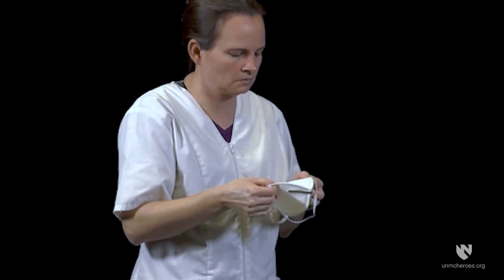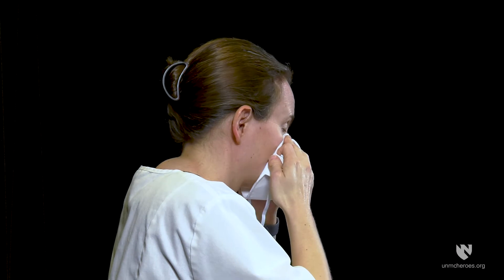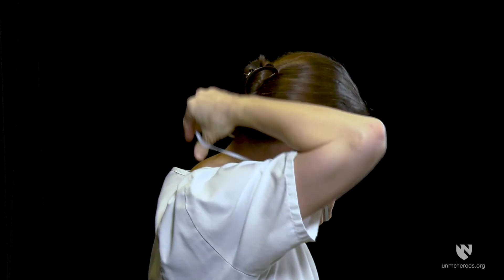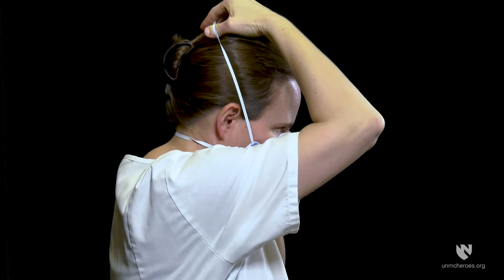Open the mask to 90 degrees, then hold the mask in your hand with rubber straps hanging forwards over the front of the nose clip. Place the mask over your nose and mouth. Place the lower rubber strap at the nape of the neck below the ears. Place the upper rubber strap at the crown of your head.